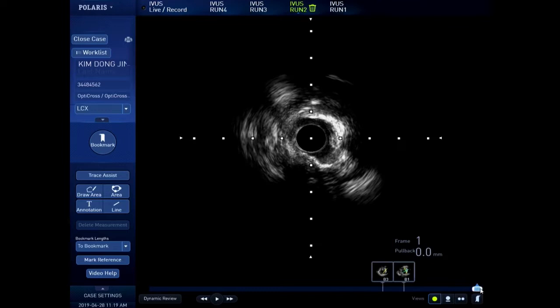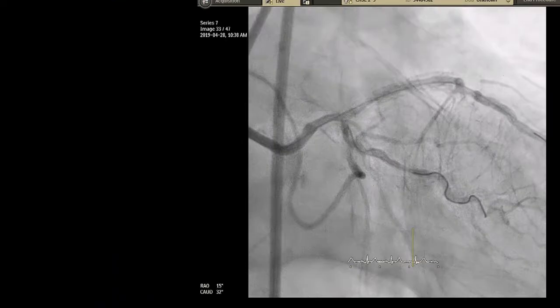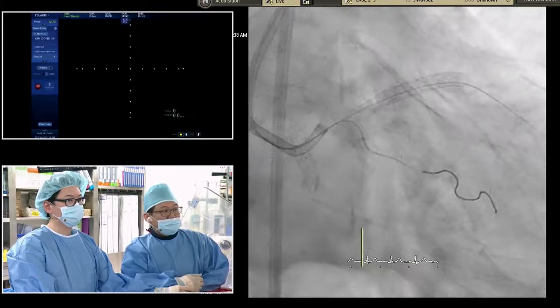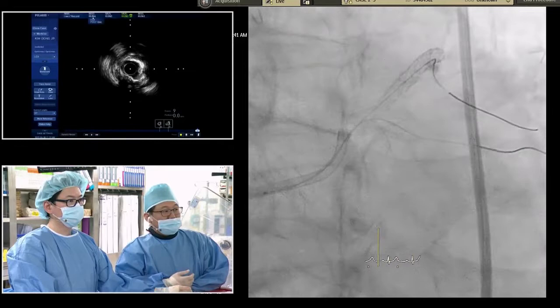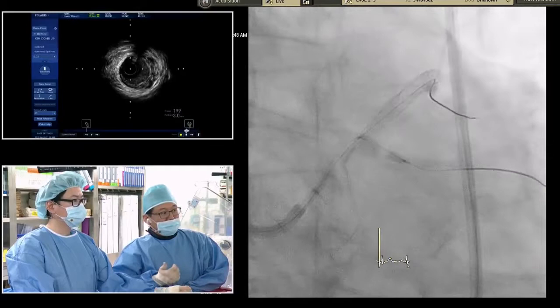Okay, I will show you. Next angiogram. What I've done is balloon dilatation using the 2.5. Next, please. Next. This is 2.5. Next, 2.5. High pressure balloon up to 28. No, there is still indentation. Next, please. This is 2.75.